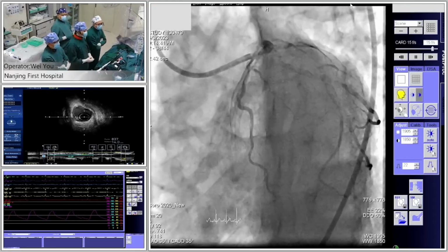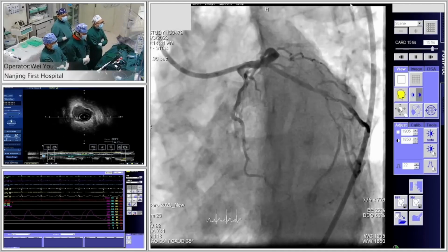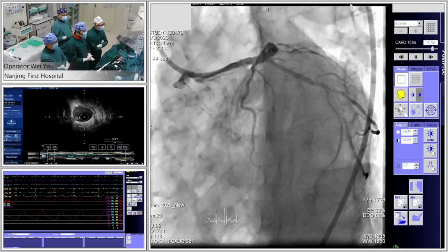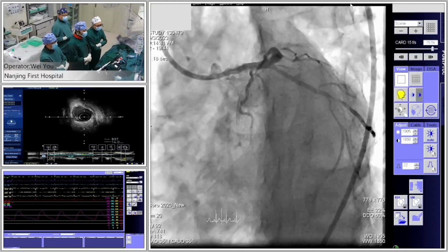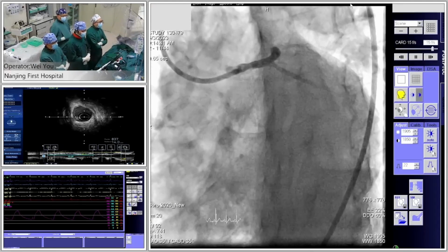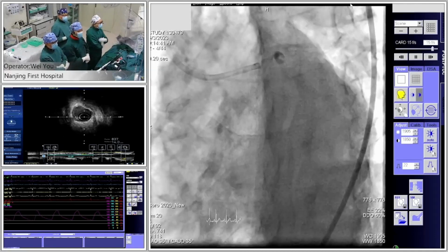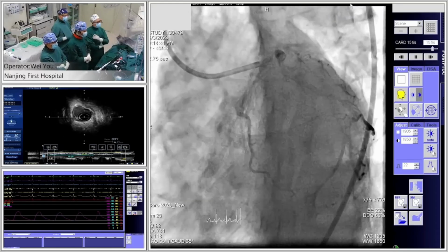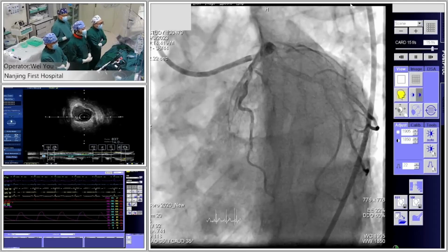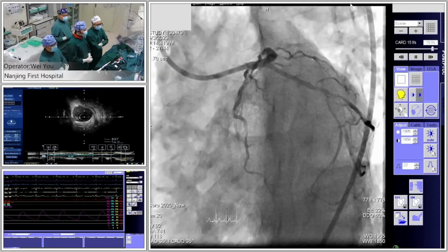Okay, thank you, Chief. Dear moderators, panel audience, and good morning. We are very happy to show you this live case transmission. On my right-hand side is Dr. Wu Xiangqi and Dr. Gan Jinxiang. The 2 doctors will assist me to perform today's case. And we also have 1 technician, our head technician, Dr. Panto, and 2 nurses, nurse Showman and nurse Jia. Okay. Next, I'd like to invite Dr. Wu to introduce the case history for you.